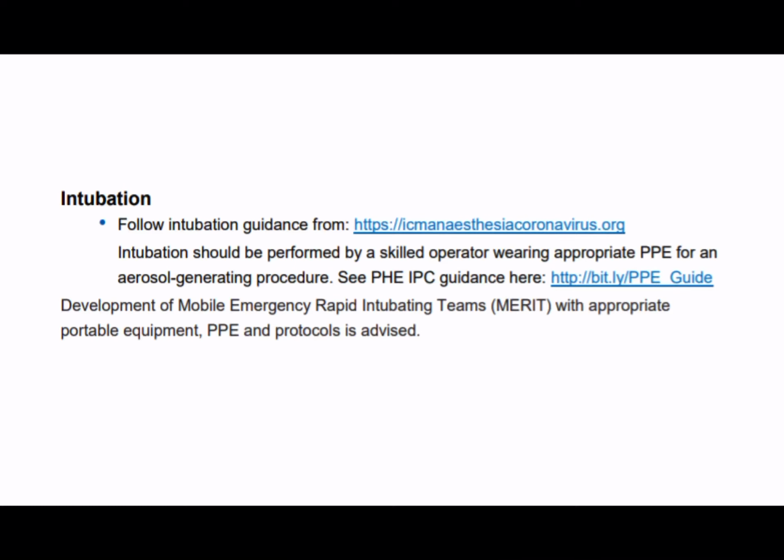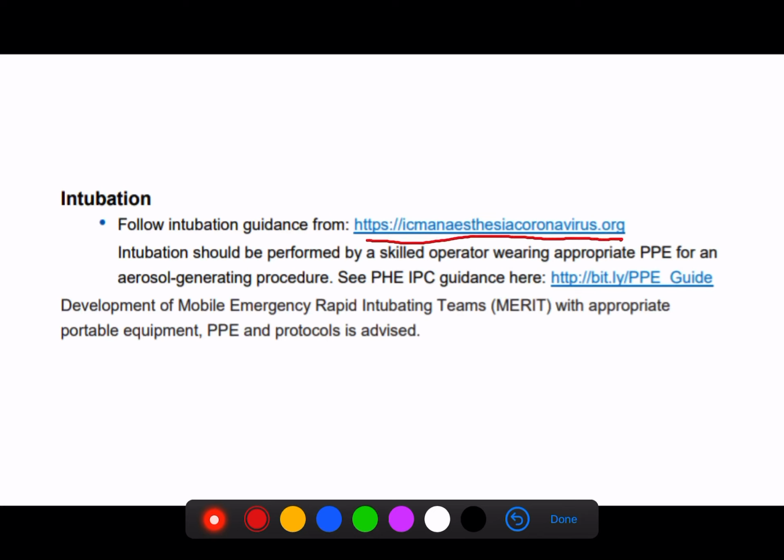In terms of intubation, there's quite a lot of guidelines out there, and I'd suggest using this particular website. It's a fantastic repository of information about the intensive care management of patients with coronavirus and goes through how to intubate these patients. The key things are that it's an aerosol generating procedure. The person intubating should be experienced and ideally using some form of video laryngoscopy so that they get the tube in first time, and also they don't have to get too close to the patient and therefore increase the risk of high doses of viral particles coming into contact with the intubator.